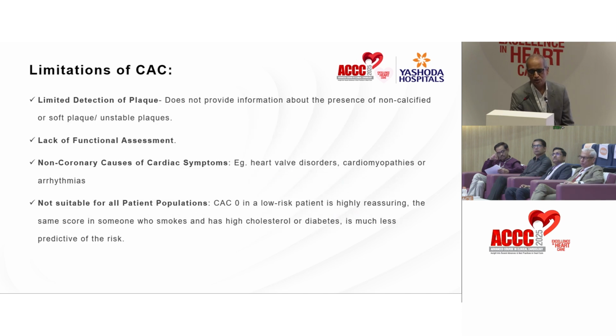The limitations of coronary artery calcium include limited detection of plaque. It only detects the calcified, high density plaque, but the low density plaque would not be evaluated. Of course, it doesn't have any functional assessment. Non-coronary causes cannot be assessed, and it's not suitable for all patient populations, especially a calcium score of 0 in a high-risk patient, such as a smoker or one with high cholesterol, doesn't mean anything. It's probably fallacious in that particular situation.